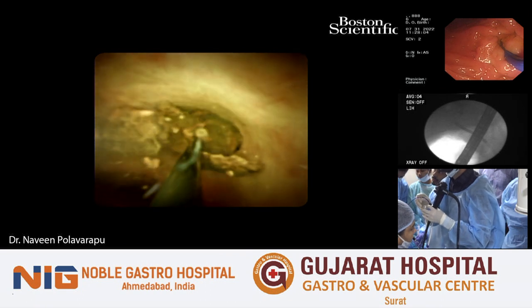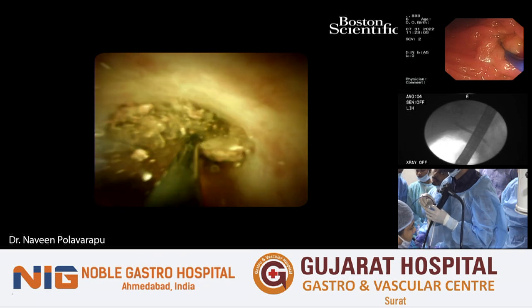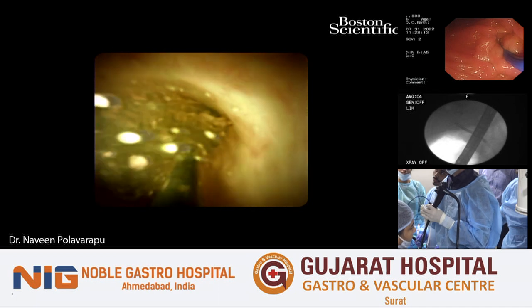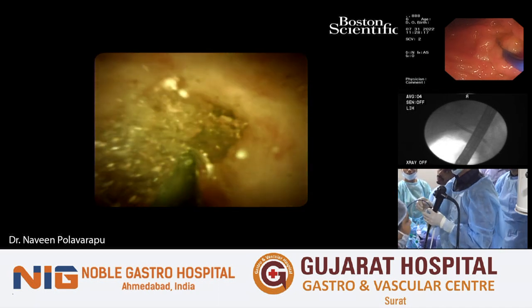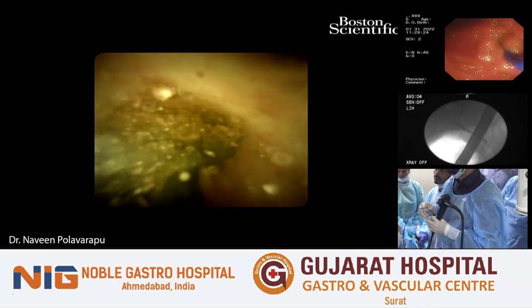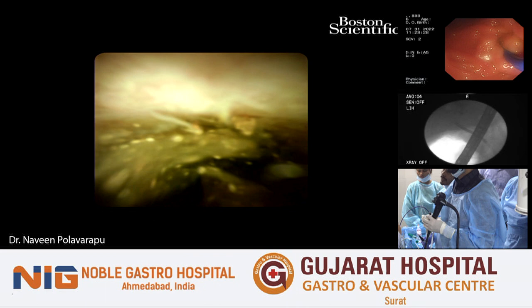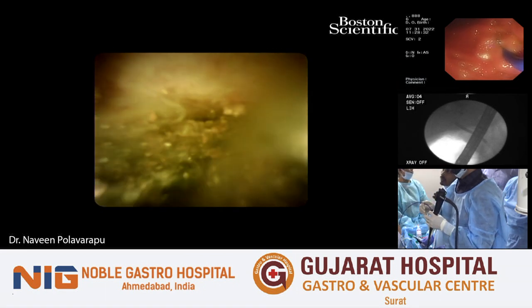You can see now, I just used another pulse. You can see it's actually shaving into the pieces. Yesterday there was a 2.5 centimeter stone which I had to break, but it was a very hard stone, and I had to go with the medium settings on the power and pulses. I had to go around 15, but generally 5 to 10 should be enough to break the stones at a low to medium power. How many shocks can you give with one probe?